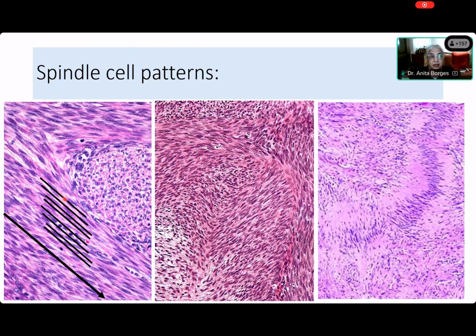Number one, you cannot get a histological fascicle. Okay? You can get a muscle, any elongated group of cells or fibers can be called a fascicle. A nerve is called a fascicle. A skeletal muscle bundle is called a fascicle, but not because it is composed of spindle cells. Histologically, if you have to define a fascicle, it must be composed of spindle cells, which are placed parallel to one another, and they run in the direction in which that fascicle is running. So they're parallel to one another, and they're parallel to the direction in which that bundle is running. Okay, so that is what is called a fascicle.